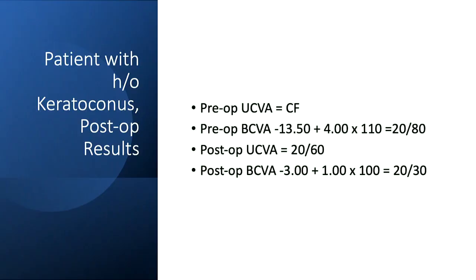Lastly, we have a 67-year-old woman with keratoconus, as we've been discussing, and here's her tomography. This was her pre- and post-op vision, and again, I went for more myopia. As Sonal discussed, we like more myopia for these keratoconus patients. They're used to being myopes, and so therefore you want to leave them with some myopia as well.